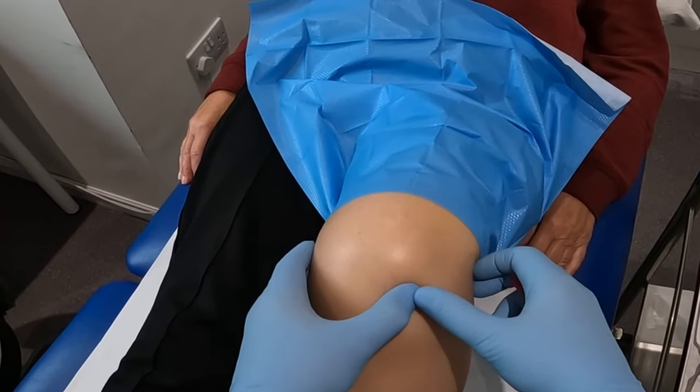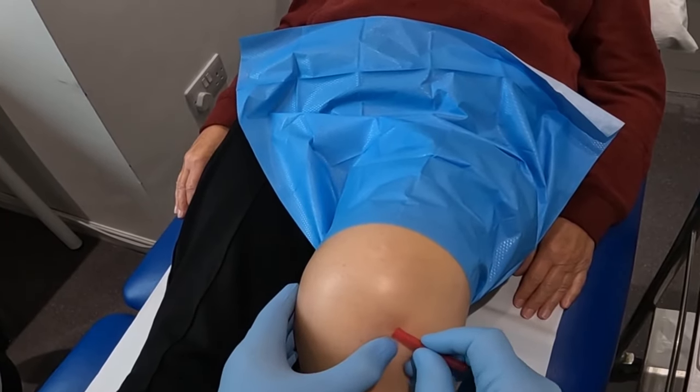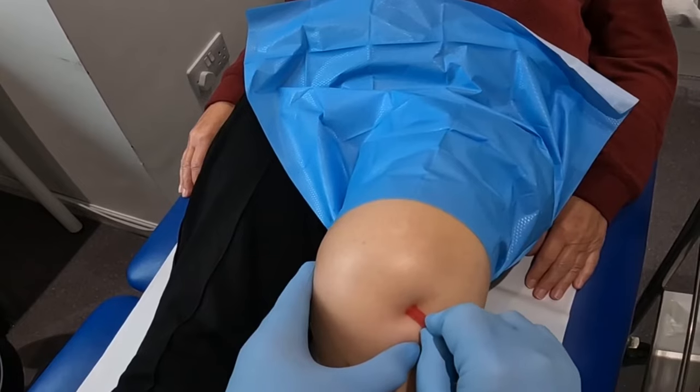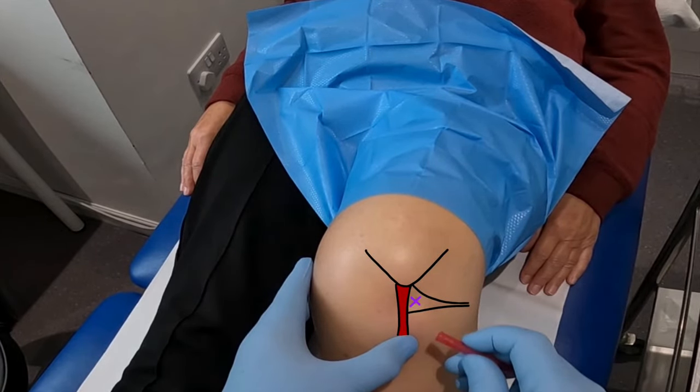The centre of this area should be a palpable soft region and is our needle entry point. The target area is essentially an imaginary triangle with the patella tendon representing its base. Note that the width of the entry point narrows the further you are from the patella tendon.